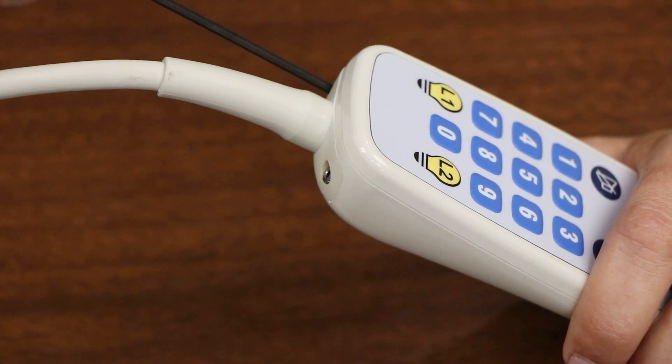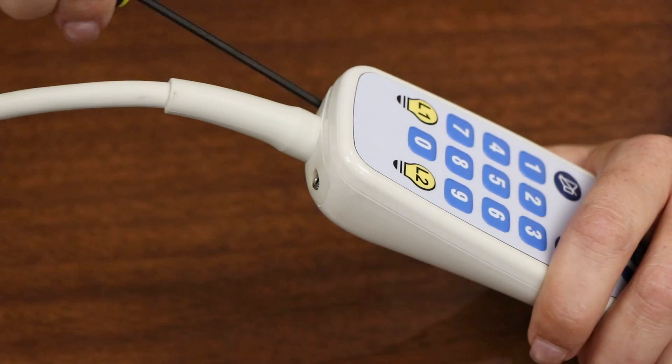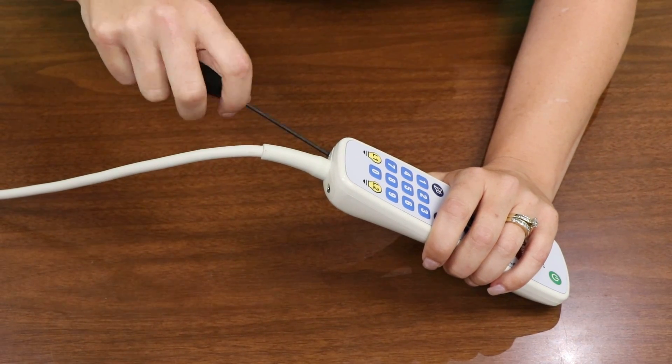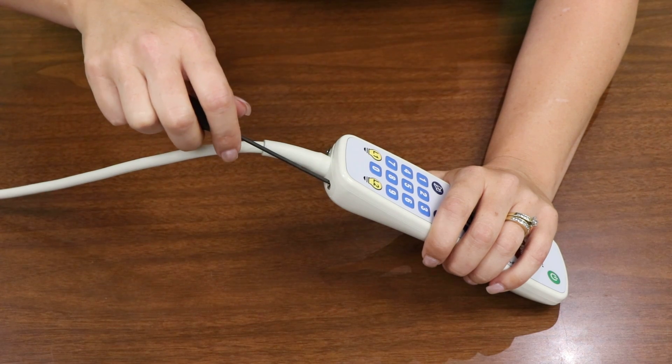From a maintenance standpoint, the single most common issue we notice with pillow speakers is cable damage. For this reason, we have designed a cable that can be replaced in 60 seconds or less.